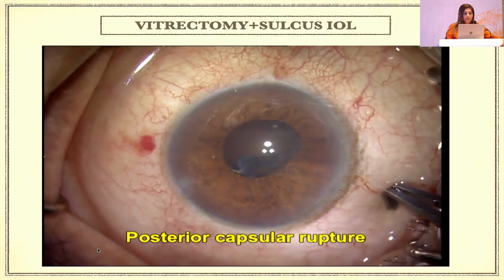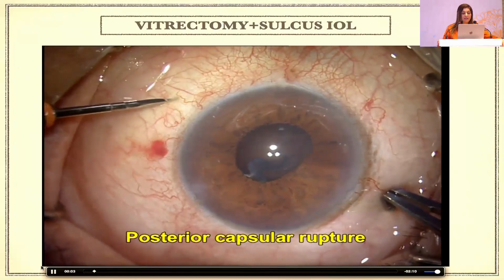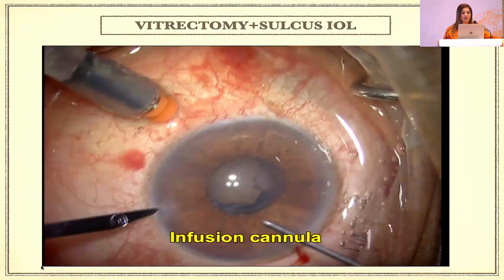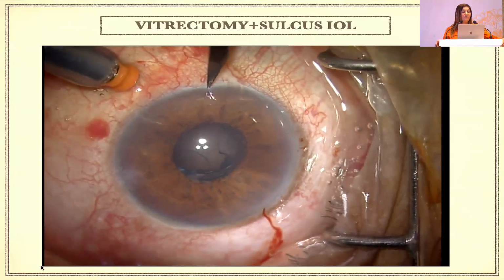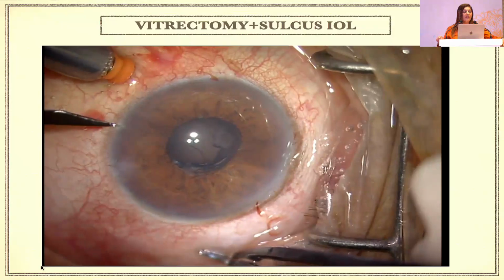Well, I'll be just showing this video. Now here, there are multiple situations going on. You have a small pupil, you have a residual cortex, but you have an intact rhexis. So what you actually do here is that you need to see inside the eye. Without seeing, you cannot do anything. And in this situation, no ring helps you.